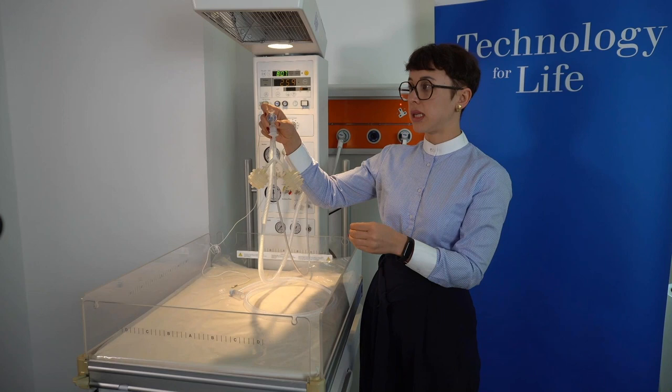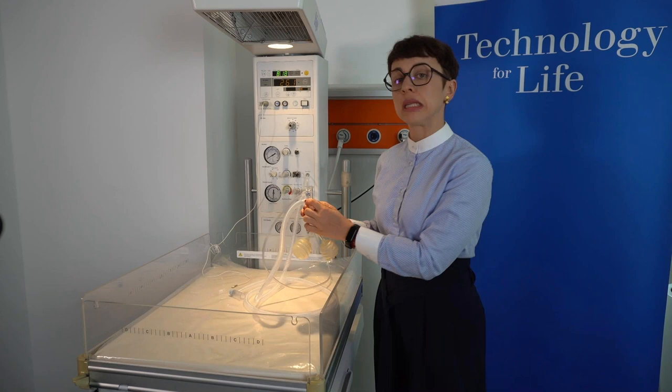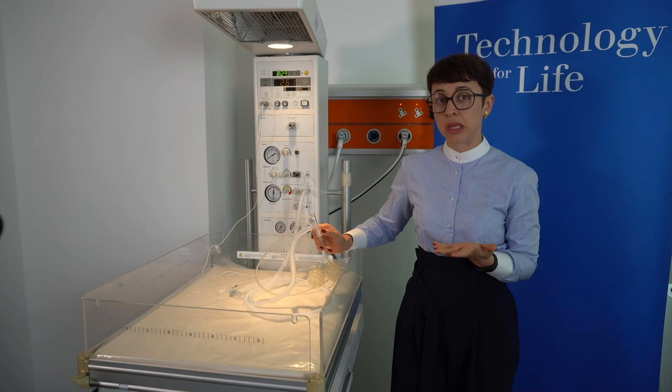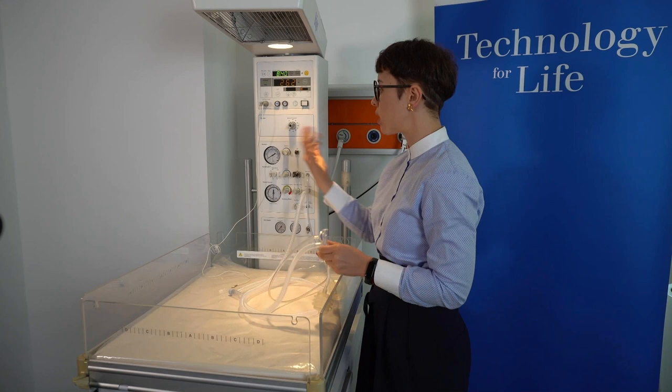And we again turn on the gas supply. And now what we need to do, as Linda was saying, is of course provide substantial or efficient respiratory support, but we also need to give our patient the possibility to start breathing spontaneously. So that's why we set the respiratory rate between 30 and 40 breaths per minute. In our case, let's say 40.